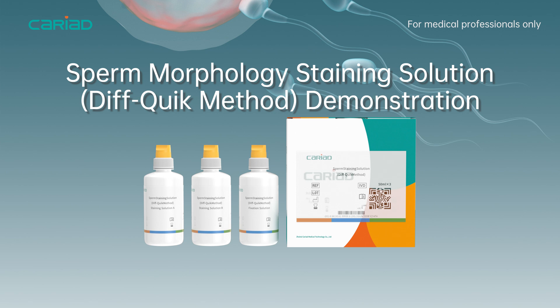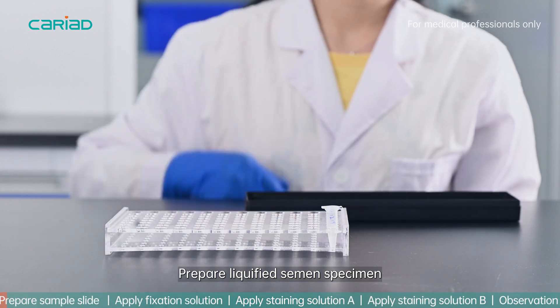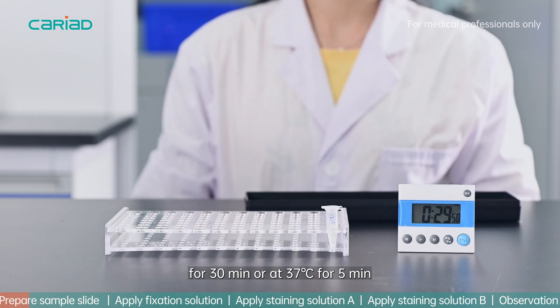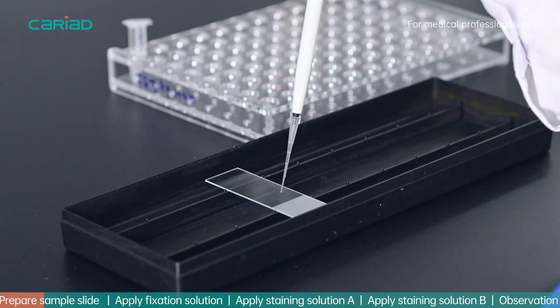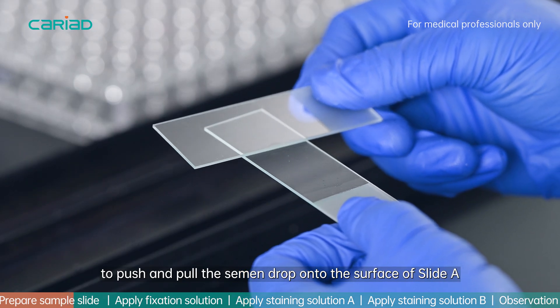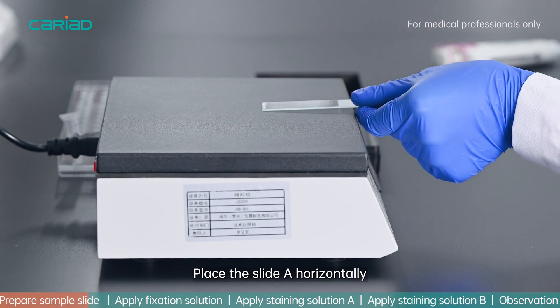Sperm morphology staining — Diff Quick method demonstration. Prepare liquefied semen specimen, equilibrate at room temperature for 30 minutes or at 37 degrees Celsius for 5 minutes. Add a small drop of semen onto a clean slide. Use the edge of another clean slide to push and pull the semen drop onto the surface of the slide.